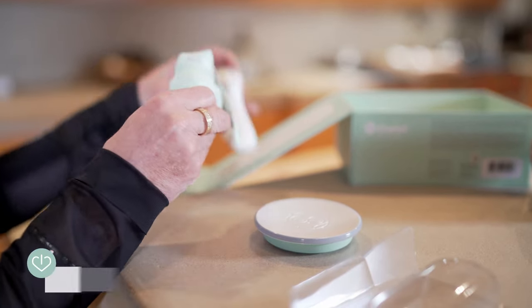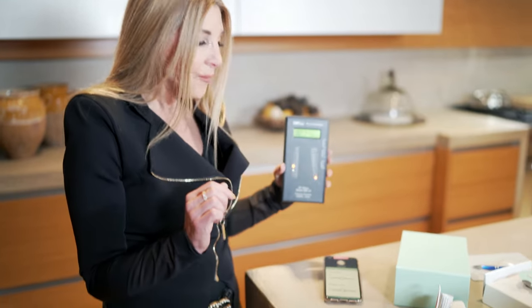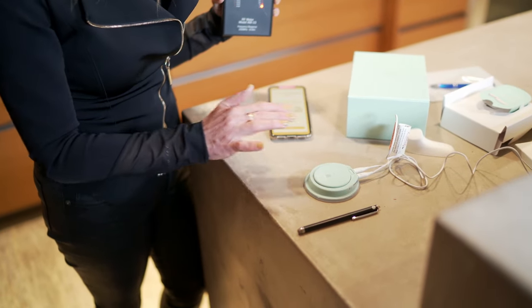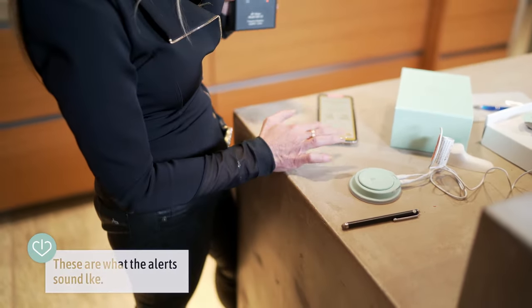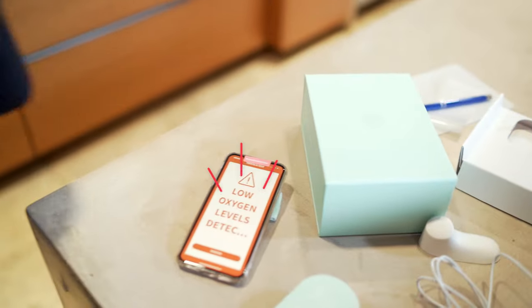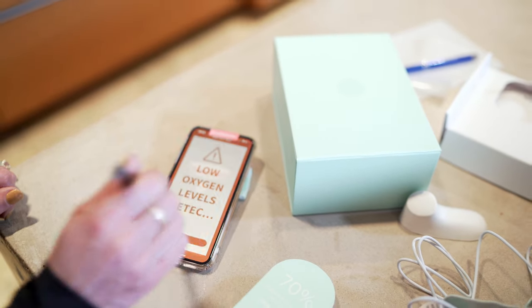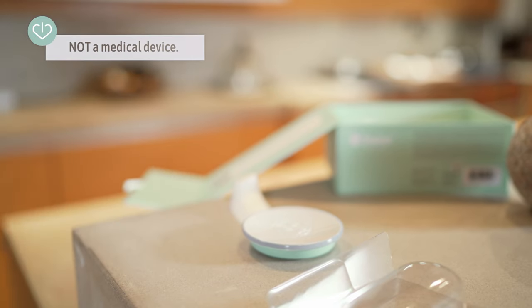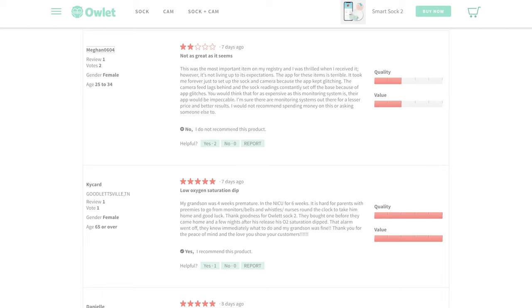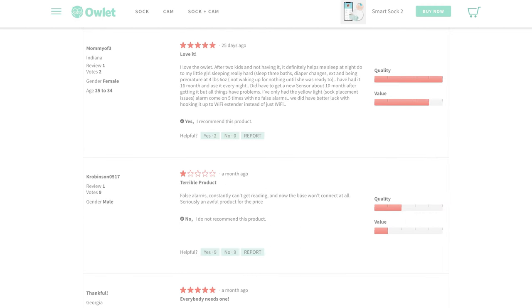You don't get video with the Owlet baby monitor. Instead it's designed to give you alerts on your phone about the baby's heartbeat and oxygen. I just did a test of red — low oxygen levels detected. Owlet reminds us that this is not a medical device, but there are reviews online from parents of NICU babies or babies with health problems that say they feel really good about using this monitor.